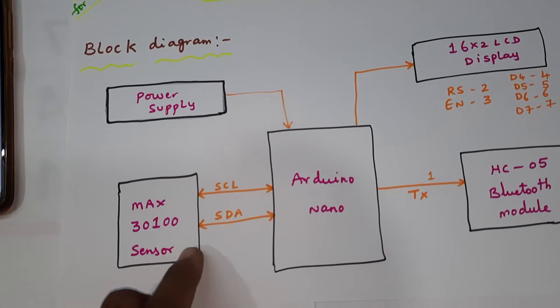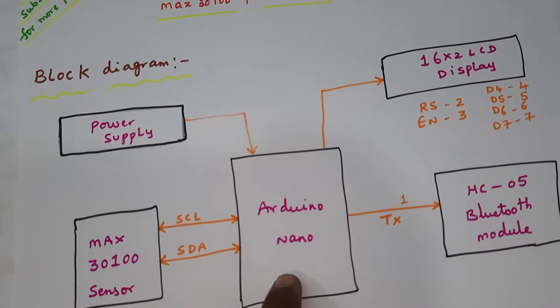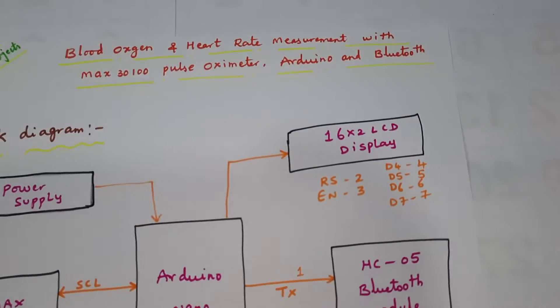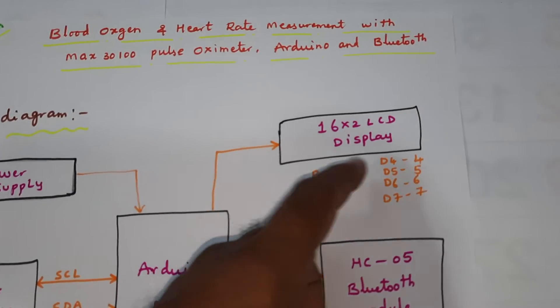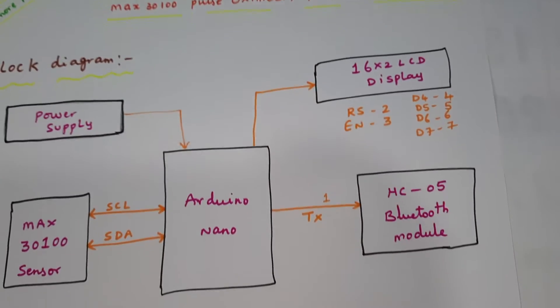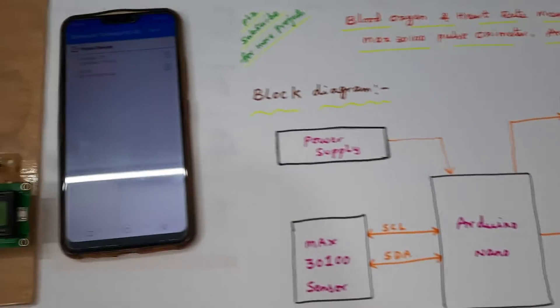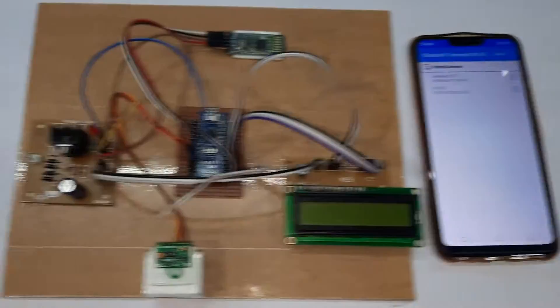The SCL and SDA lines are connected to A4 and A5 of the Arduino Nano board. The 16x2 LCD display uses RS, Enable, D4, D5, D6, D7 connected to GPIO pins 2, 3, 4, 5, 6, 7. We are also monitoring on the HC-05 Bluetooth serial terminal module.